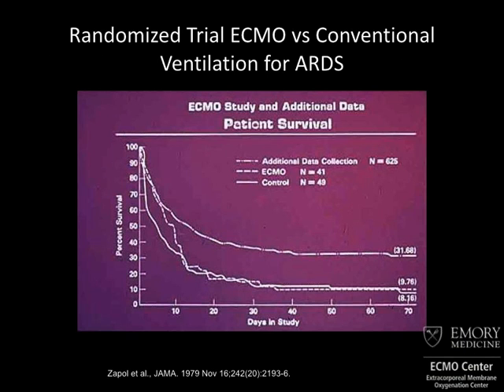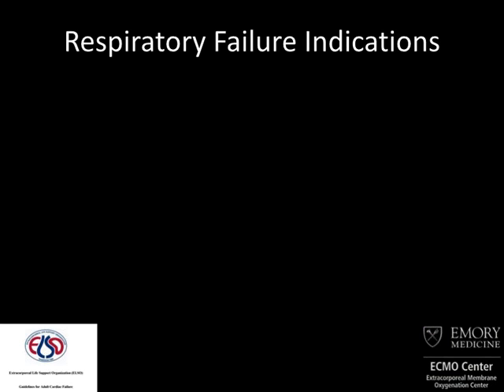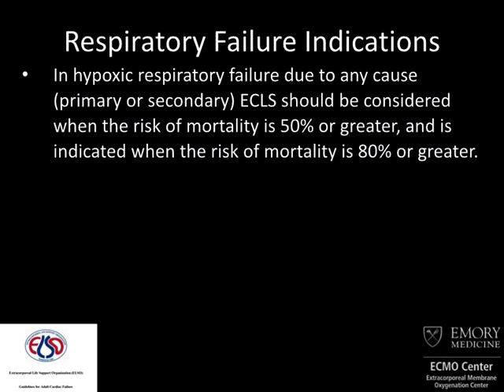And everyone said for years, this has been done and tried, and it doesn't work, pointing to this slide. Things have changed, however, and ELSO has continued to make progress on this and has some clear indications for respiratory failure. The first of which is they say their opinion is that it should be considered where the risk of mortality is 50% from ARDS, and they consider it indicated when the risk of mortality is 80% or greater.